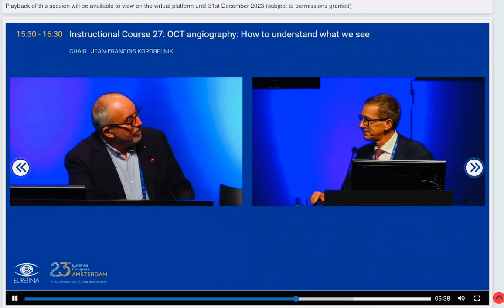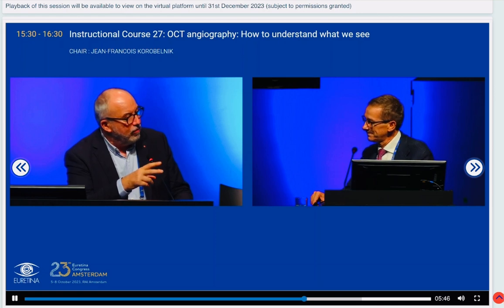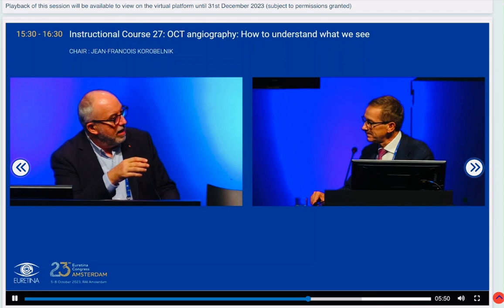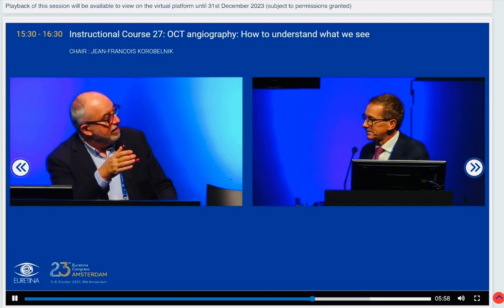Thank you very much, Giovanni. Always wonderful images and a lot of logic to try to understand what we see. I have a question for you for wet AMD. We'll discuss wet AMD with Nicole, but how often do you do the OCTA for wet AMD cases? Baseline, each visit, never?